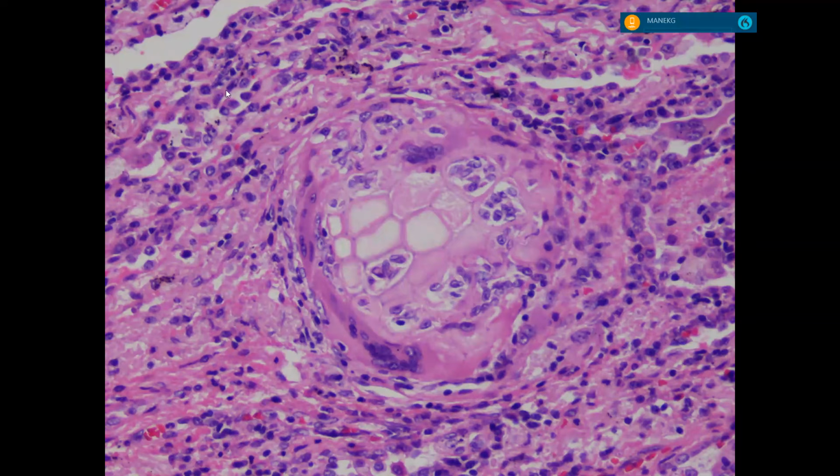Okay. So yes, this is a foreign body. These little squarish things, that is a vegetable particle. And this cell that's trying to eat up this thing is a multinucleated giant cell. It's perceiving this vegetable as foreign in the lung and it's trying to remove it. So this is the classic appearance of when you aspirate food into your lung and it causes a foreign body reaction.